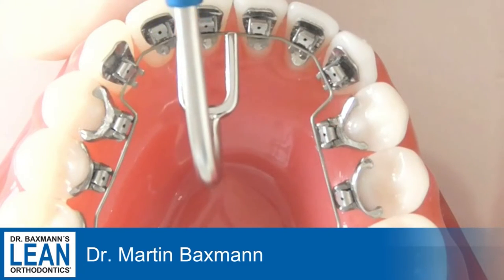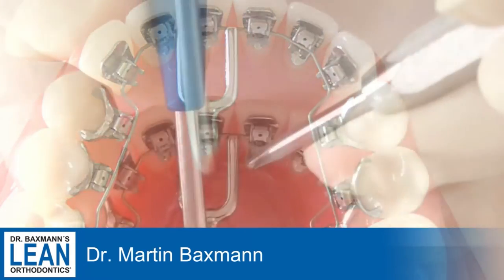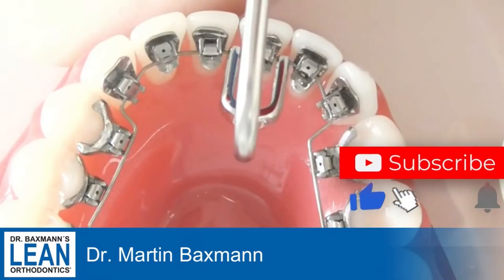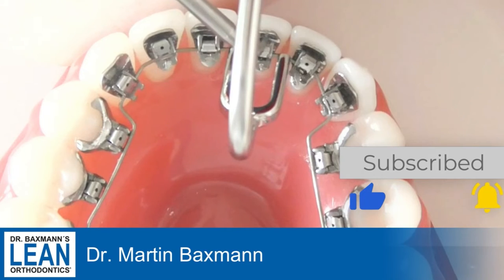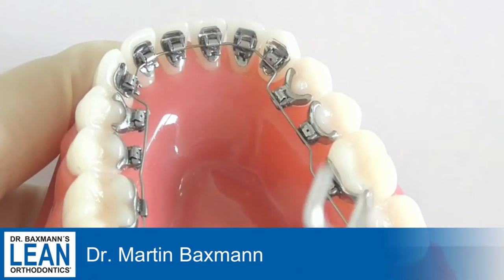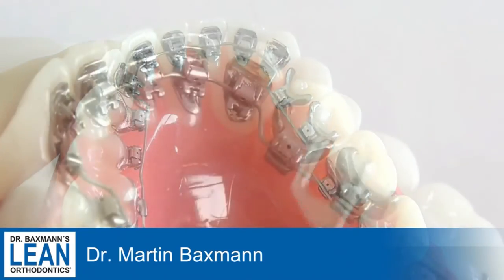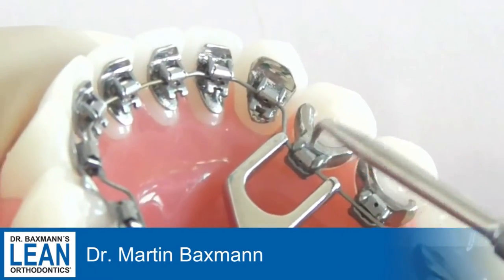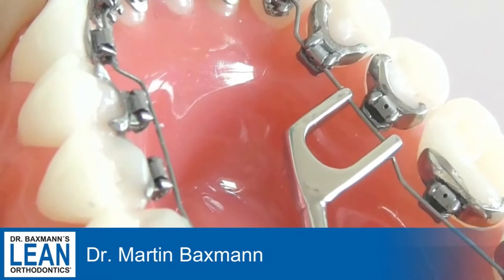It has two ends — one for the front teeth, so you can pull the wire into the slot, close the slot easily with a closing instrument, and have full sight of the full slot. The same instrument works at the back with one end for posterior teeth.